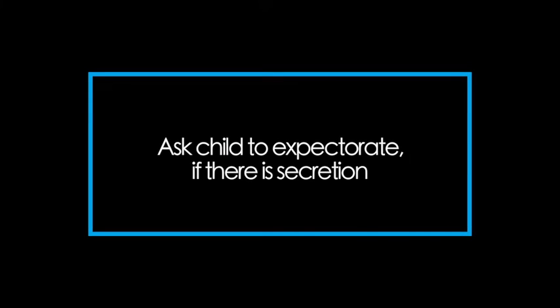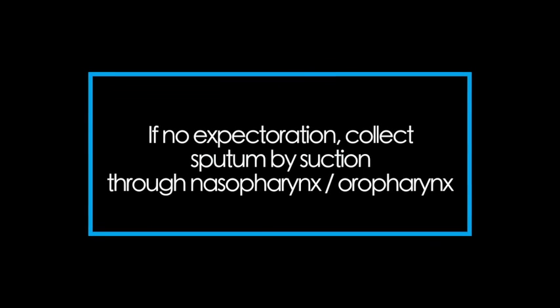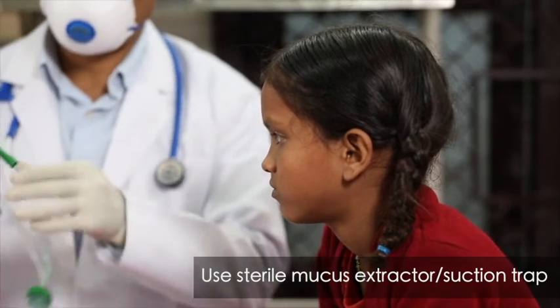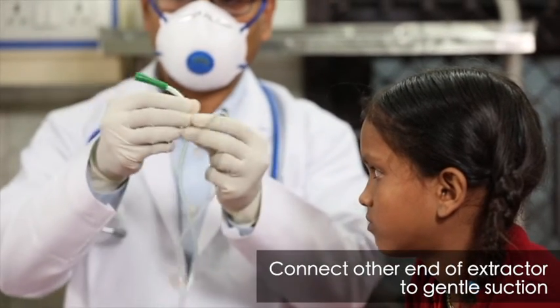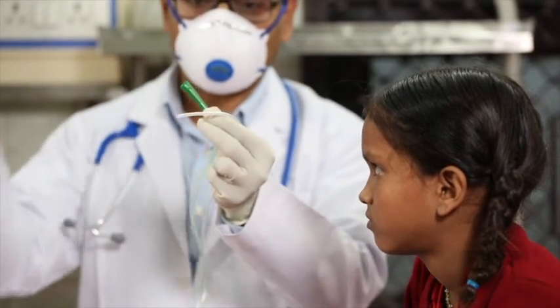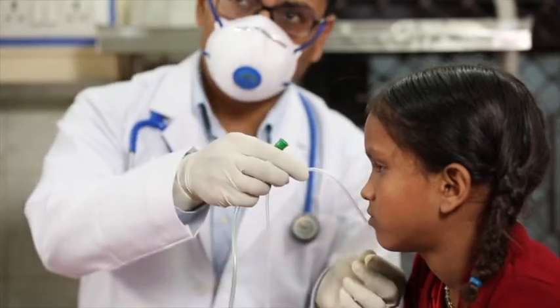If there is sputum production and child can expectorate, collect the sputum in sterile container. If still child is unable to expectorate, or if it is a young child who needs assistance to collect secretions, then sputum can be collected by suction through nasopharynx or oropharynx. Use sterile mucus extractor or suction trap with the other end of the extractor connected to gentle suction of around 100 centimeters of water.